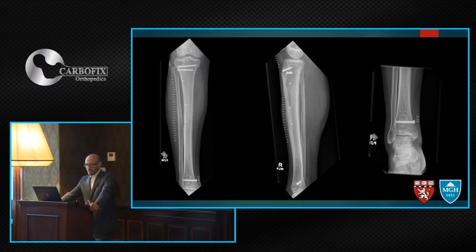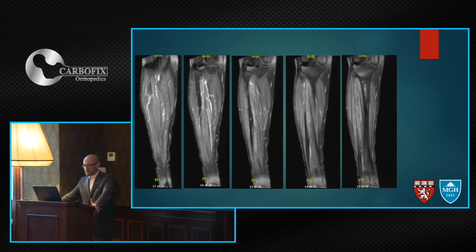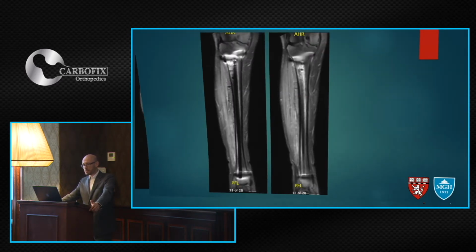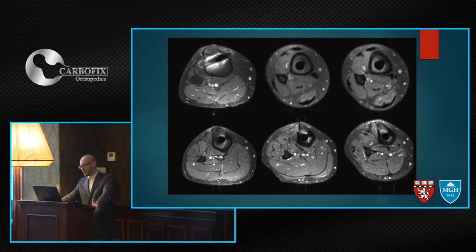But to get a good margin, I have to take the periosteum of the tibia and a little bit of a sleeve of the bone of the tibia. And then I protected his bone with a radiolucent nail. And then this is a follow-up MRI, and it's nice because you can see what is happening. When the patient is anxious and asking you, is it back or is it not back, what do you see, you actually can tell them, I can see that there is nothing so far.